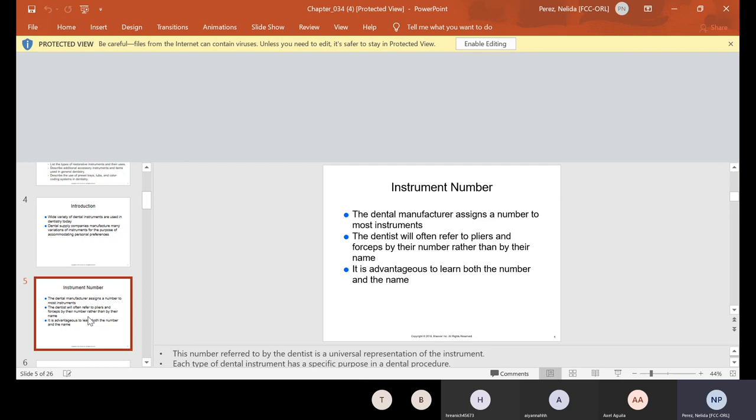Now instruments have instrument numbers and usually the manufacturer assigns a number to most instruments. It makes it easier for you to order it if you happen to need that instrument. The dentist will often refer to pliers and forceps by their number rather than their name, which in a way is kind of easier for you guys, because if you don't remember the name, you just look at the number on the forcep.